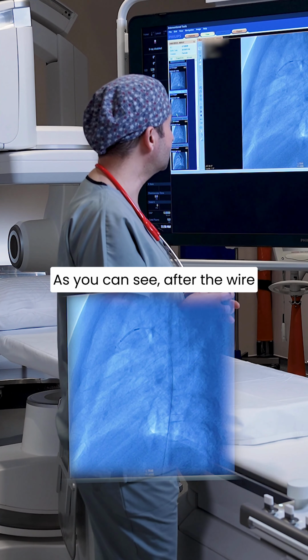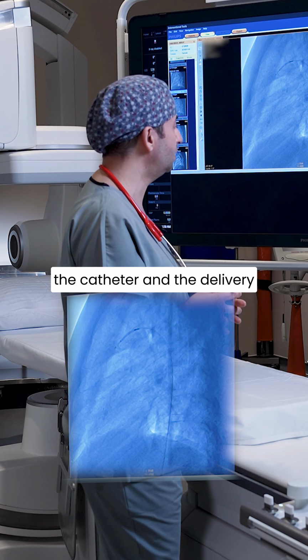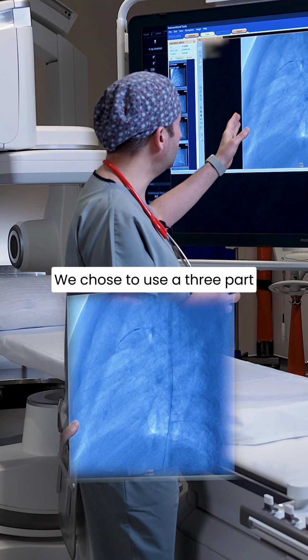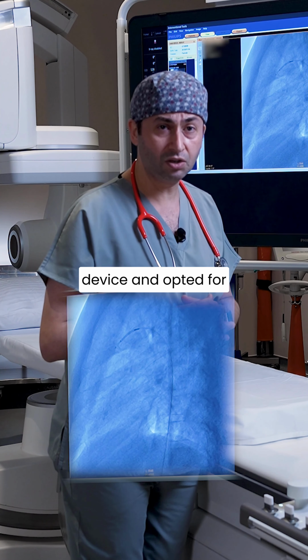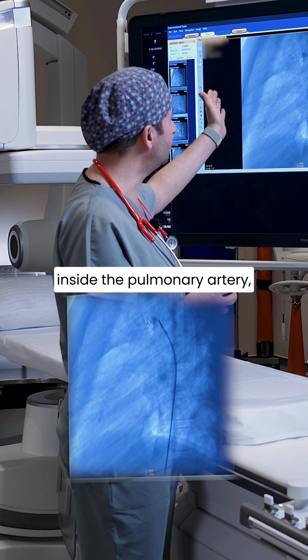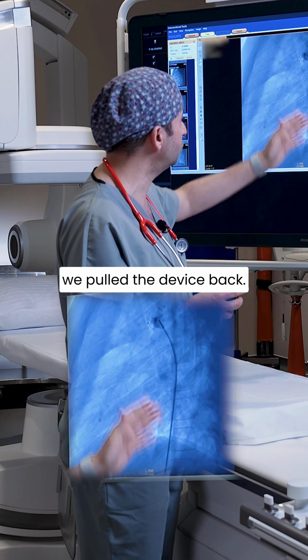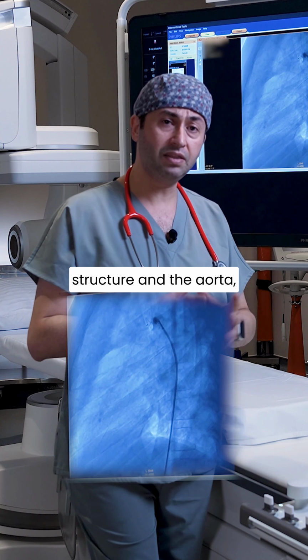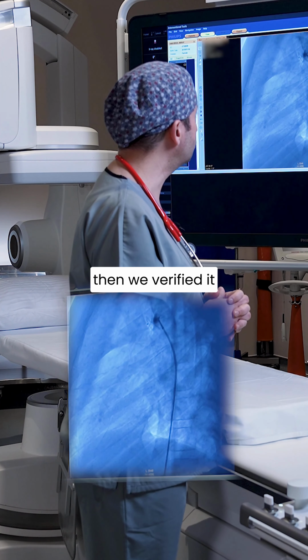As you can see, after the wire passed through, we inserted the catheter and the delivery tube for the device into the pulmonary artery. We chose to use a 3-part device and opted for the arterial approach here. After deploying the first part inside the pulmonary artery, we pulled the device back. We deployed the second and third parts within this abnormal structure and the aorta. Then we verified it with an injection.